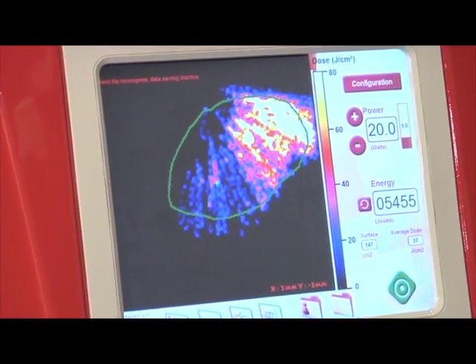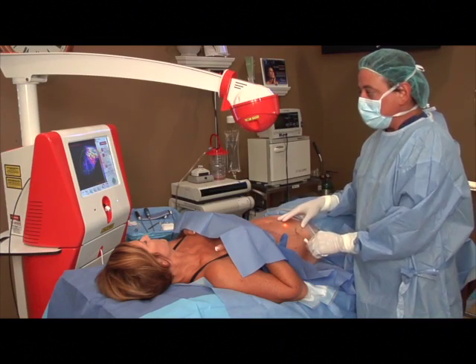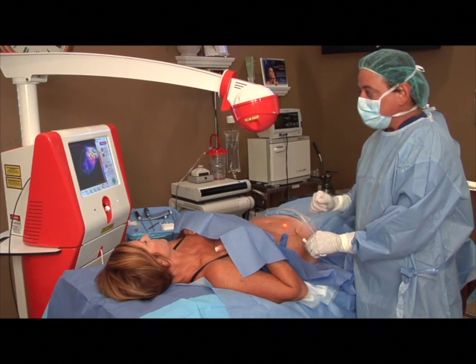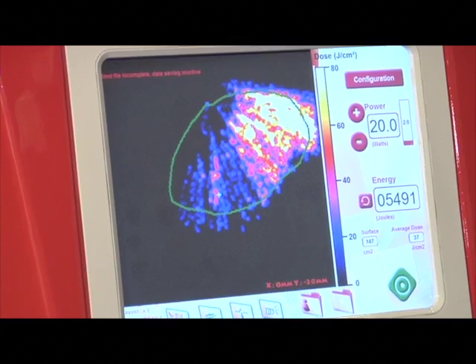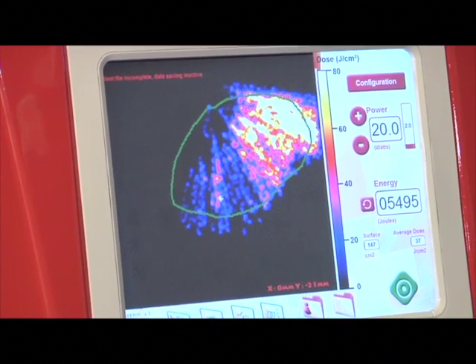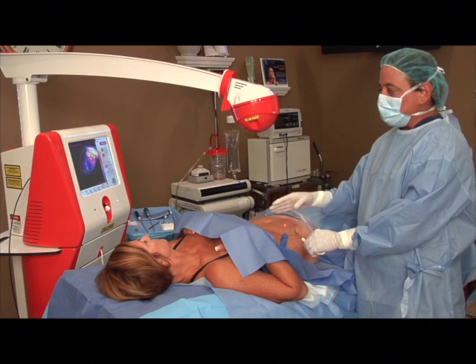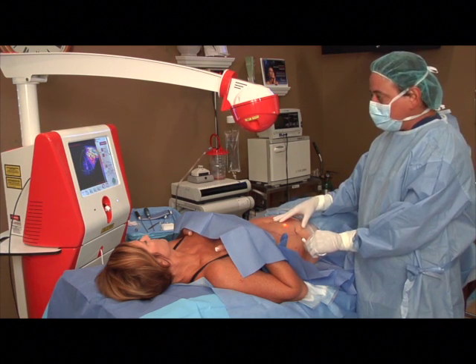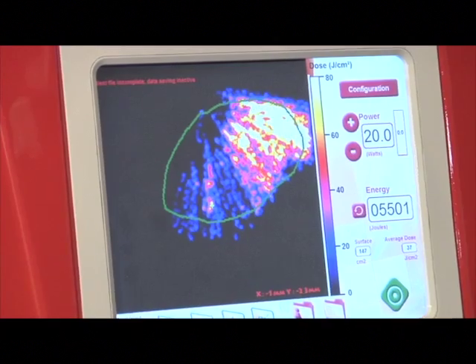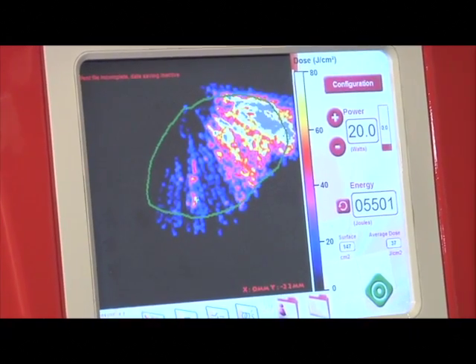Now, one of the safety mechanisms of this machine is that if you stop moving your hand and just hold still, you'll notice the laser turns off and you see the color has not changed. So if you just forget and hold on to the laser, it allows you not to burn the patient, because the laser, you hear the sound firing, but it's actually not producing any energy in that area.